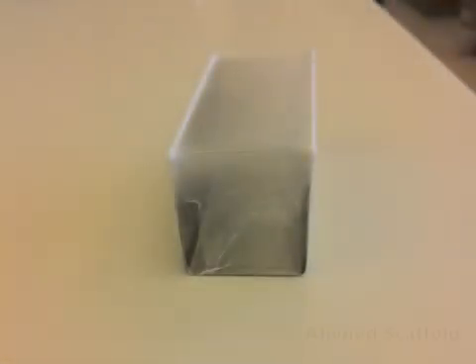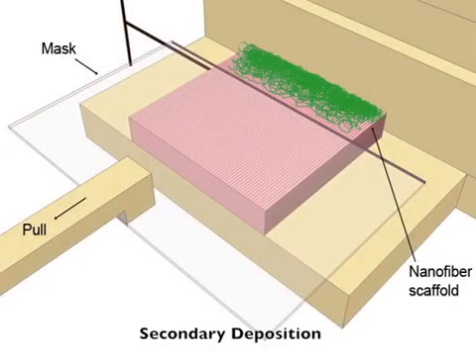In this protocol, we spun a polycaprolactone polymer onto a gap collector to form a uniaxially aligned fiber substrate. Then, we used a gradually moving mask to cover this substrate while random PCL fibers were deposited.